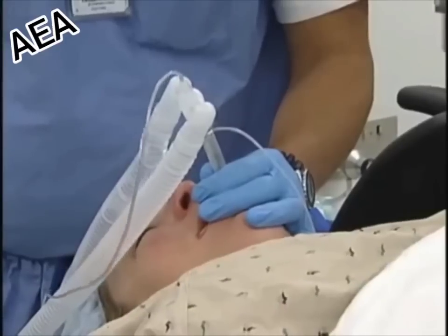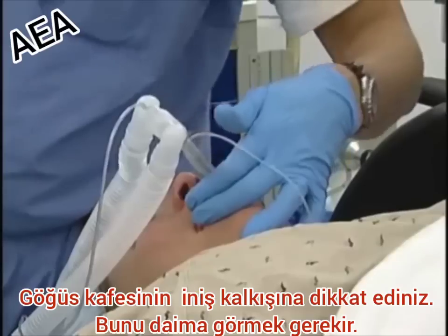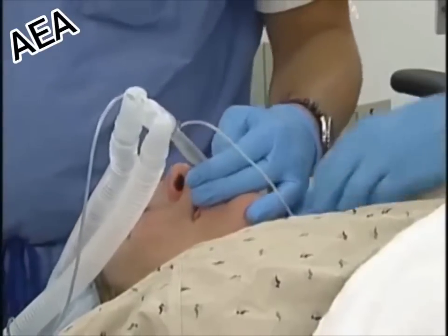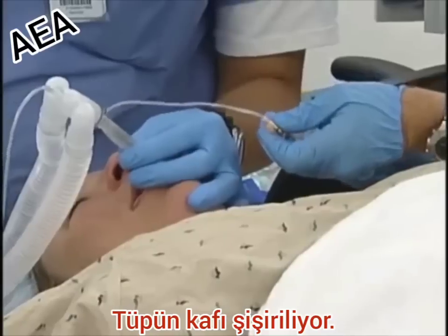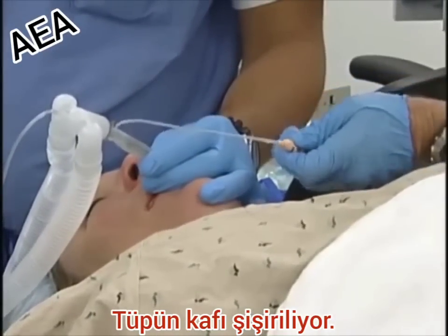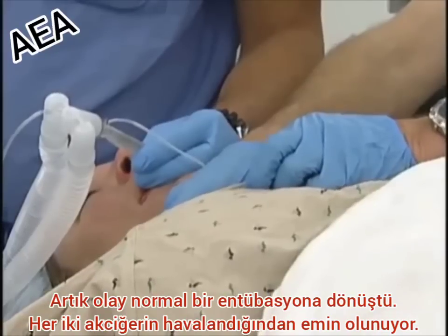Reconnect. What's our distance there, Scott? Can you turn the desk back on? Let's pull back just a centimeter. Equal breath sounds bilaterally.